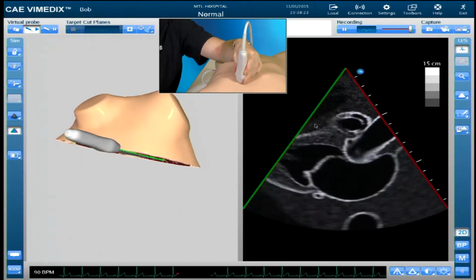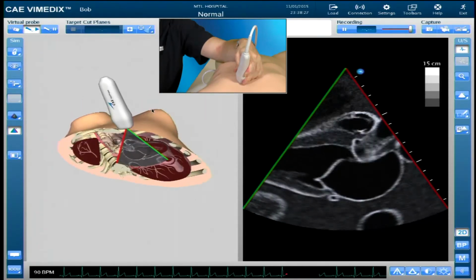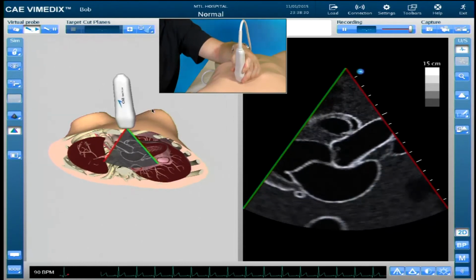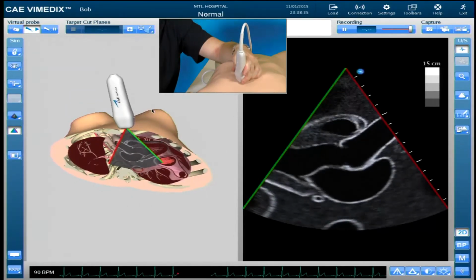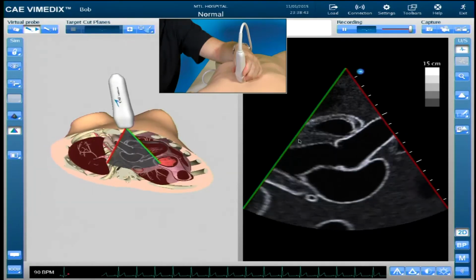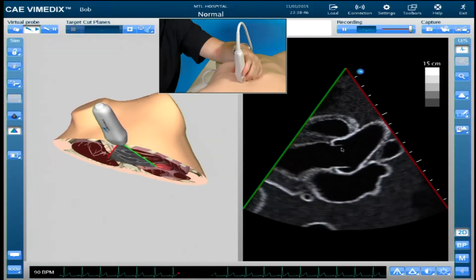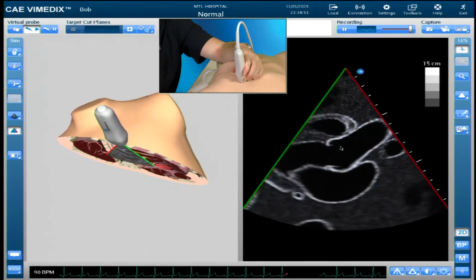If you want to look at the left ventricle, you can tip down a little bit more, pointing towards the patient's left hip. Okay? So just have that idea of what a perfect picture needs to be in your head, of seeing that aortic valve and mitral valve sitting in the center of the image, looking up that gun barrel of the heart. You do a little bit of rotating, trying to open up that ventricle as much as you can, and then fanning through it to open it up again as much as you possibly can.